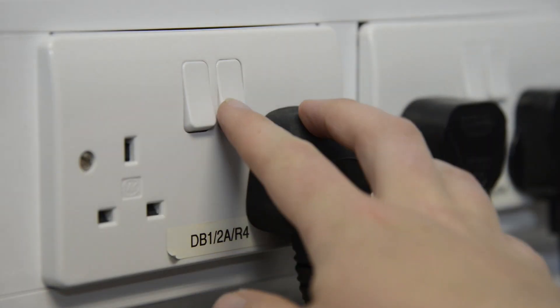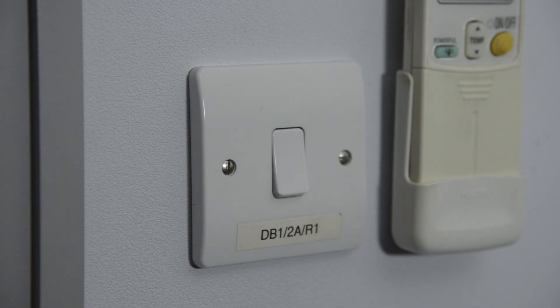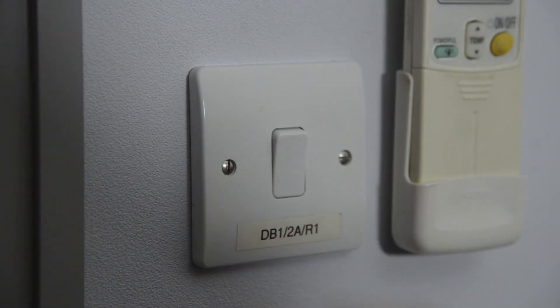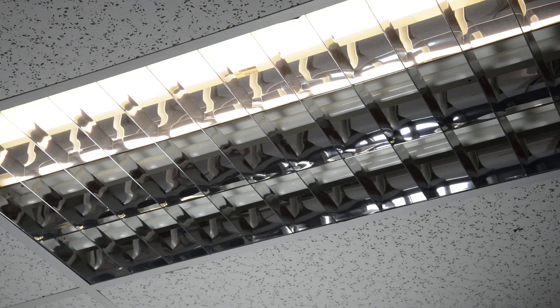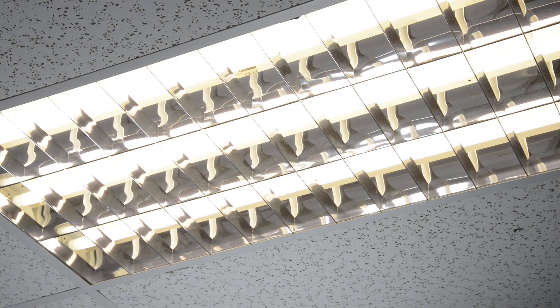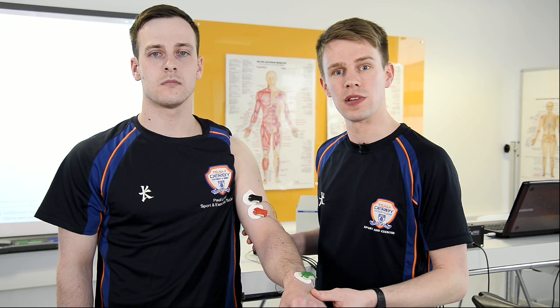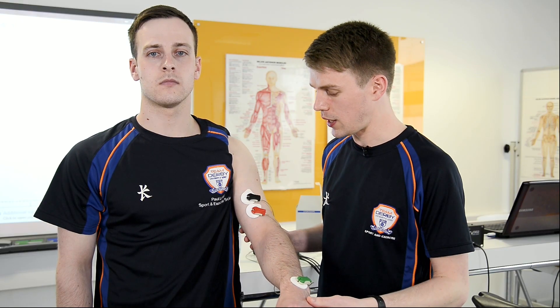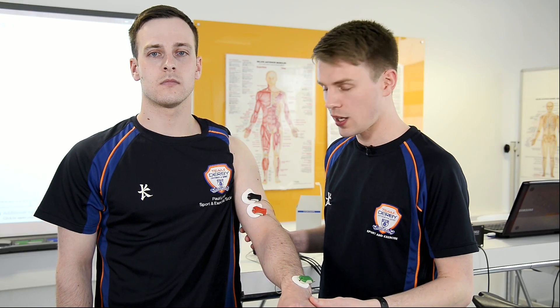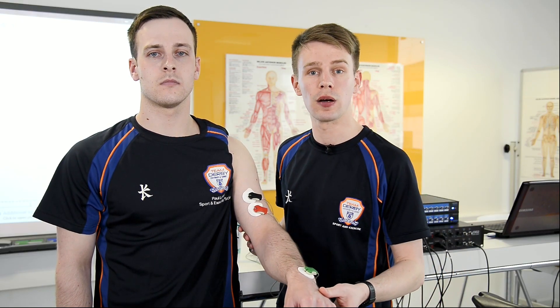The electrodes and wires are now in place to record from Paul's biceps muscle. However, there are other sources of electrical noise all around us. Power lines in the walls and ceilings, fluorescent lights, and other pieces of electrical equipment all give out an electrical signal. Whatever the source of this noise, it is also picked up by our electrodes. However, this problem can be overcome by using differential recording.